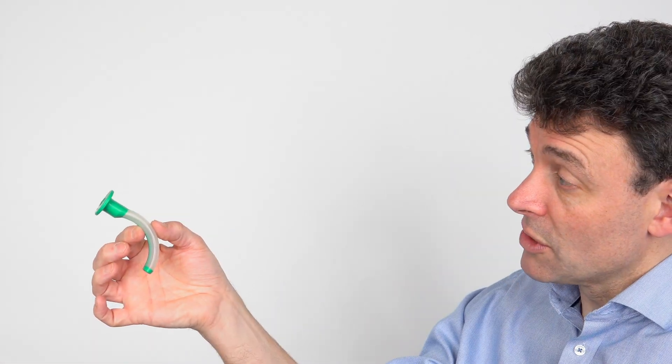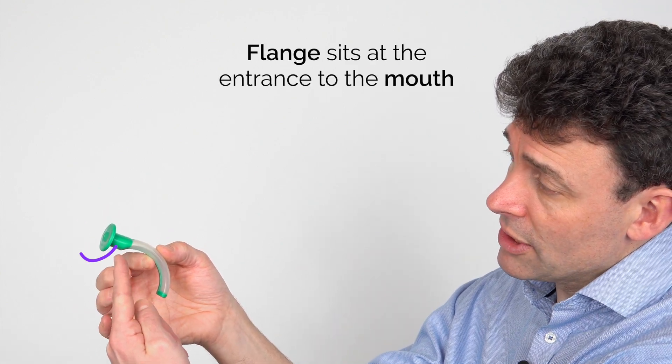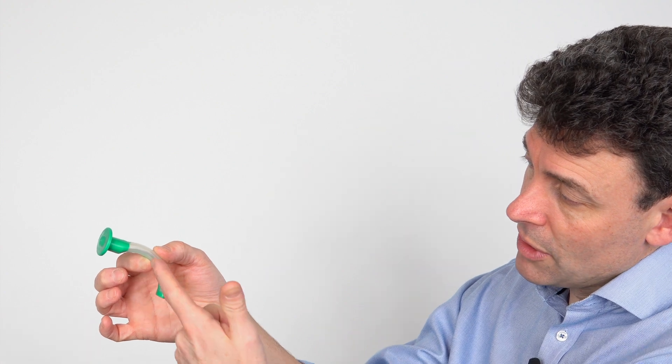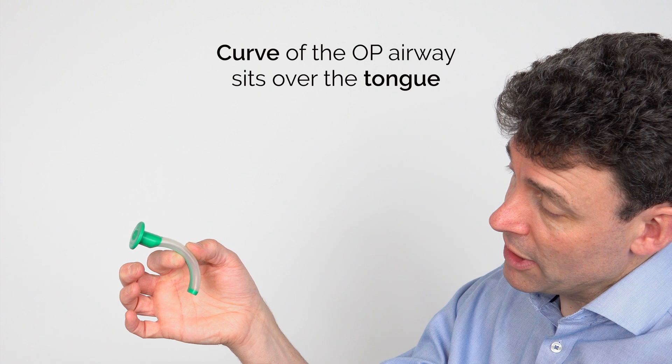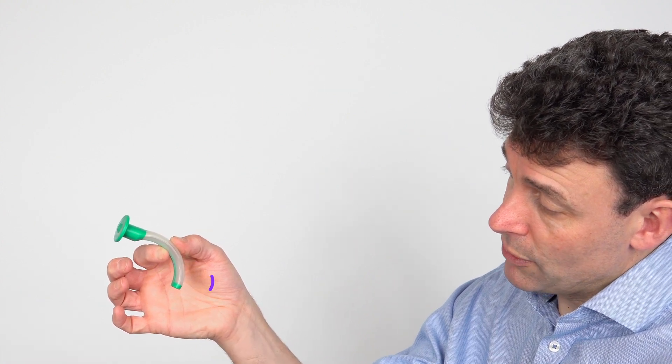This is an average sized oropharyngeal airway, sometimes referred to as a Guedel airway. At the top we have the flange that's going to sit at the entrance to the mouth with the teeth coming down just on this reinforced bit of plastic. This natural curve helps support the tongue and keep the tongue away from the airway, with the tube sitting neatly at the back of the oropharynx.